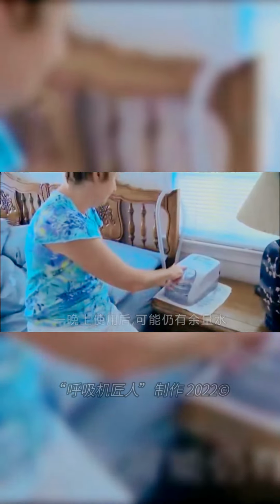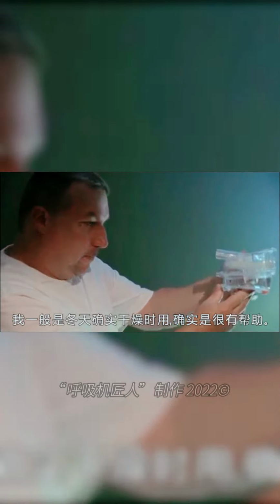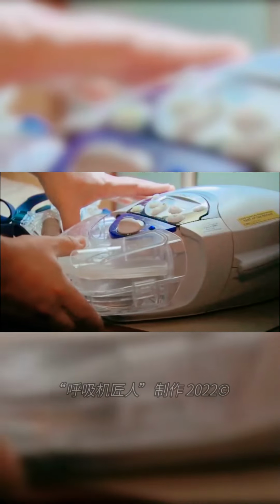The amount of water remaining in the humidifier chamber after a night's sleep will be dependent on the heater setting as well as the temperature of your room. I would also recommend to use the humidifier feature. I started this at the end of a winter season when the air was quite dry and found that really did help quite a lot.